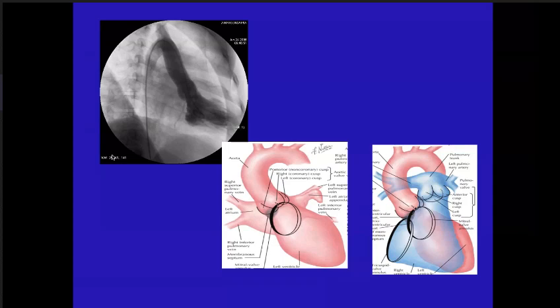No. So don't call it cranial. You have to be careful. Just because the diaphragm is seen, don't jump to the conclusion that it is cranial. You have to see whether the heart is overlapping the diaphragm or not. Somebody opens the field from head to foot, from here to here, you will see the diaphragm. You will not only see it, you will even see the pelvic bones if you open enough. That doesn't make it cranial. The heart has to overlap the diaphragm.